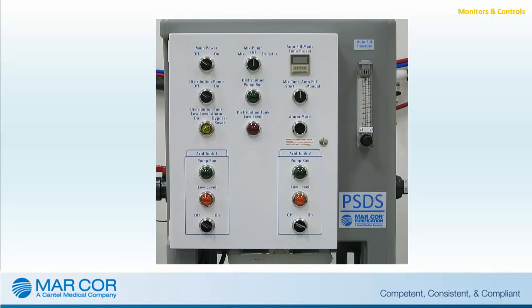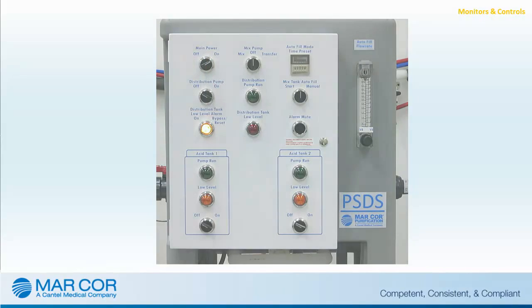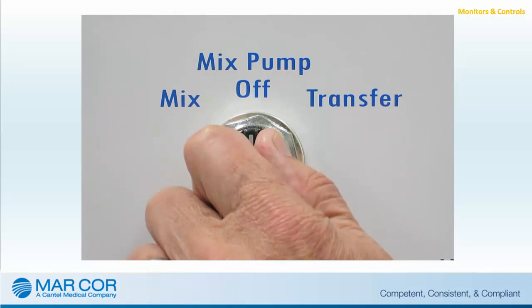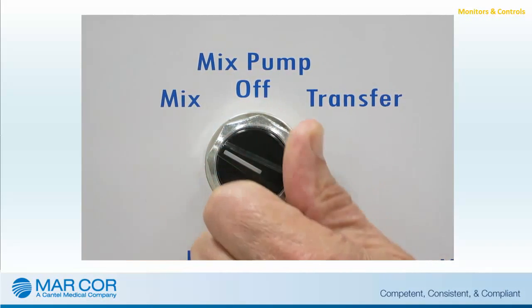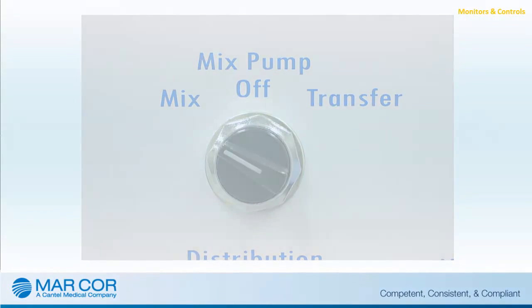The main power switch is located on the front of the control panel and must be turned to the ON position to operate the PSDS. The mix pump switch is a three-position switch that controls power to the pump and is used to mix the powdered bicarb in the mixed tank and then to transfer the bicarb solution to the distribution tank.